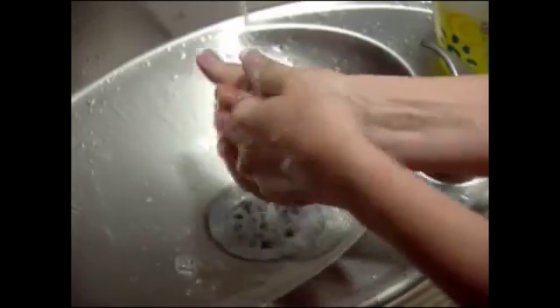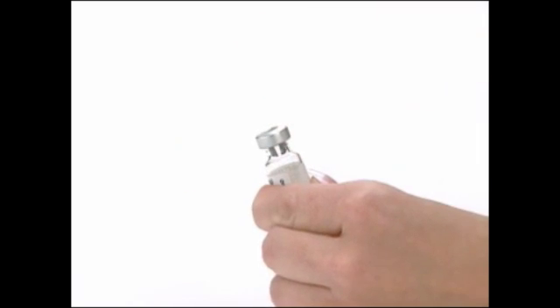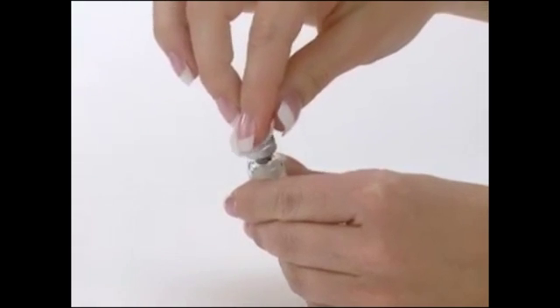Wash your hands with soap and water and make sure you are working on a clean, flat surface. Using your thumb, flip the protective plastic cap off the Gonal F RFF vial. Wipe the top of the vial with an alcohol swab.